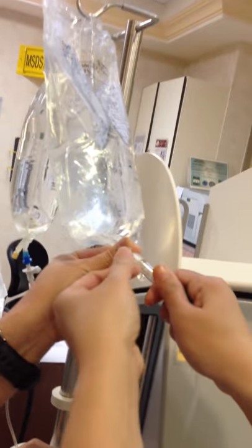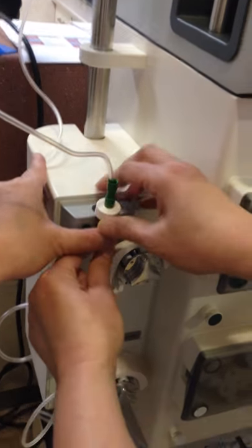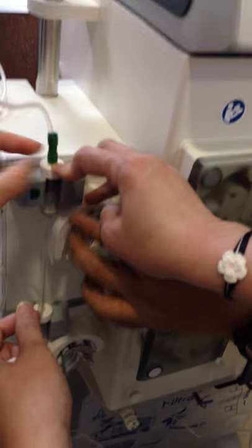And then connect the citrate port to the citrate bag. Observe the no touch technique. Next, install the citrate drip chamber in the drop counter. Where's the drop counter? There's a sensor there. Make sure it's all fully done. And this must be empty.